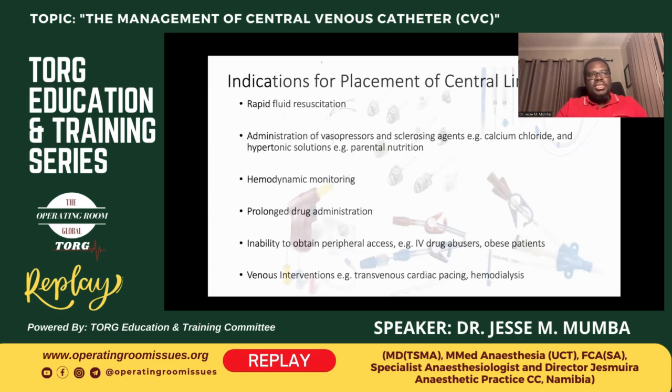In most cases, we insert them for fluid resuscitation, and also for patients who are critically ill and need medication that may sclerose the peripheral system, so vasopressors and other very concentrated hypertonic solutions, such as parenteral nutrition, even administration of, say, 50% dextrose.